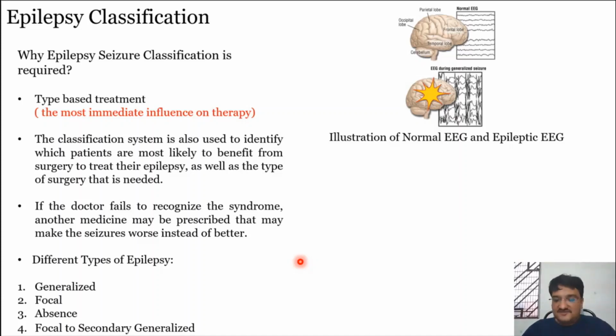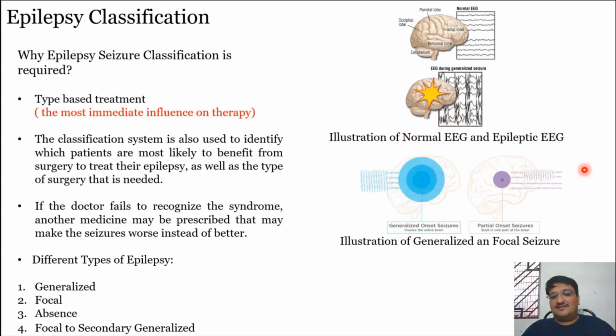International League Against Epilepsy. Now coming back here, this has been useful to differentiate between normal and epileptic EEG. How do we delineate between partial seizure and generalized seizure, or focal seizure and generalized seizure?